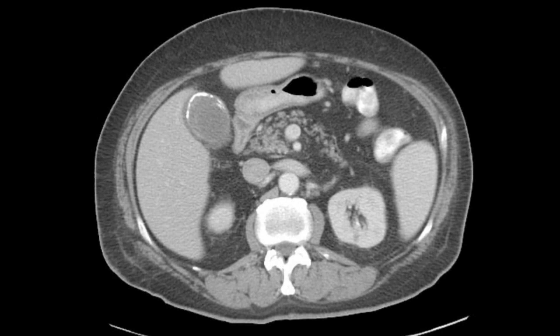Here is another example of a CT axial image to show you how porcelain gallbladder appears on CT. These images will help you shape your final diagnosis and report that the gallbladder wall is calcified and suggestive of porcelain gallbladder.